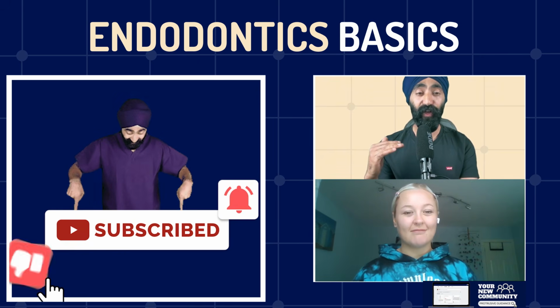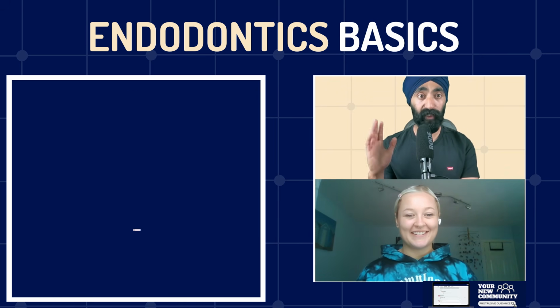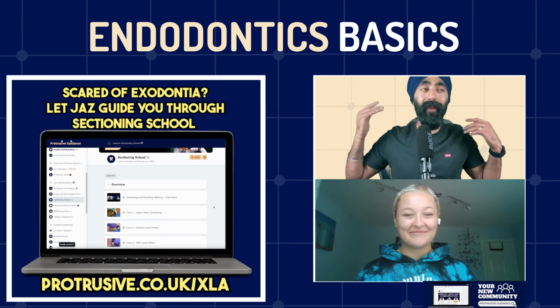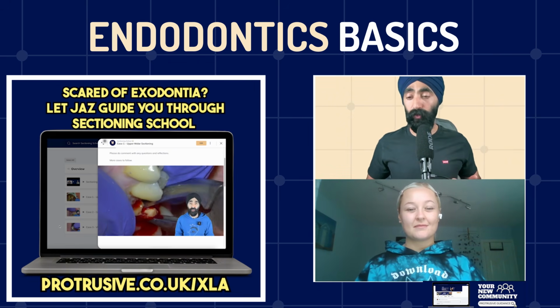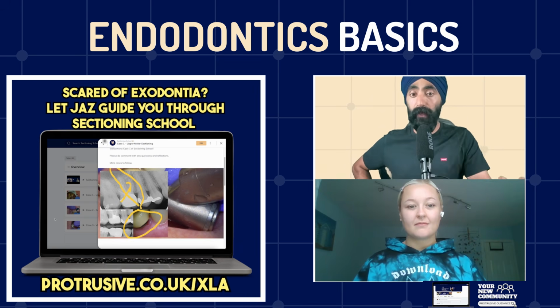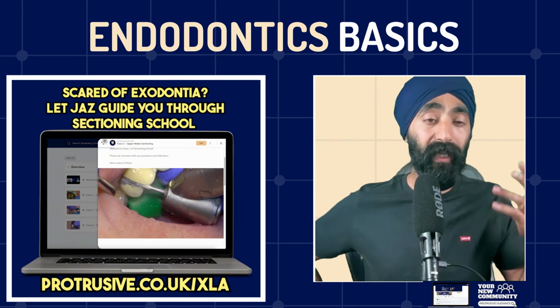So this quote unquote dodgy root canal has been there. Sometimes you see something that's poorly obturated, a single file floating in the canal space, but there's no infection. So by using saline as irrigation, sticking a couple of files in there, sticking a GP cone in there, maybe, I'm just postulating, you will get a 50 to 60% success rate just by closing it up and giving a coronal seal.